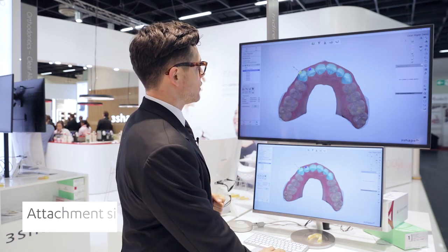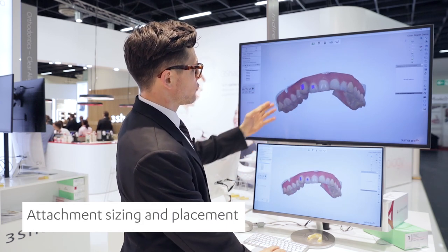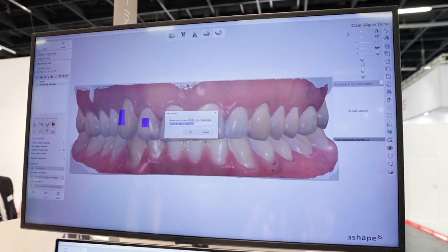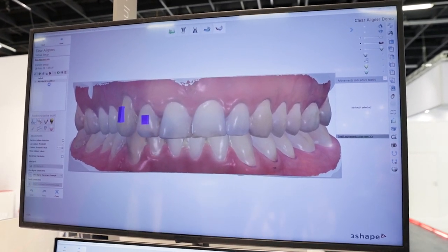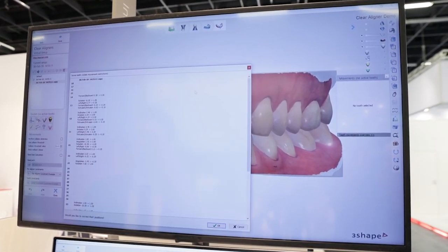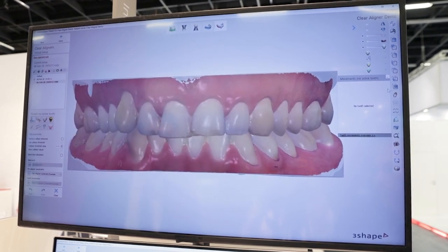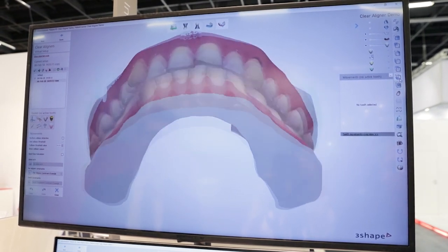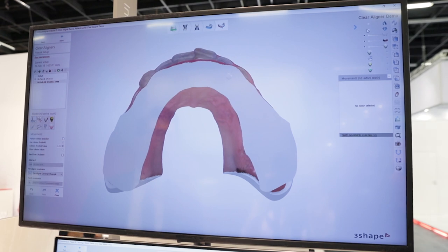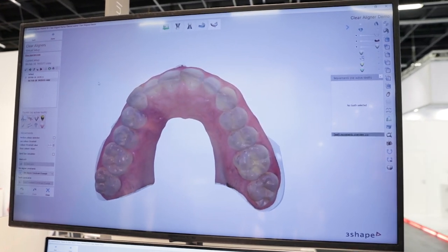This is real time. It basically identified that for these two teeth it needed an attachment. These were based on constraints and parameters that I set — for instance, the canine over a certain threshold of rotation, please add an attachment. The system does it automatically. Very nice — big time saver there.